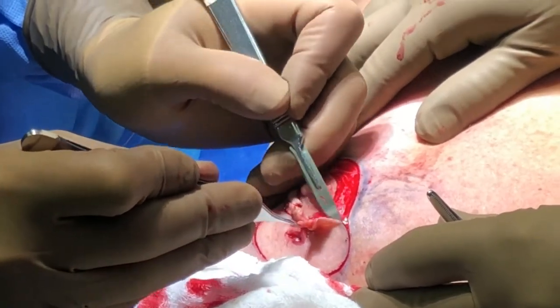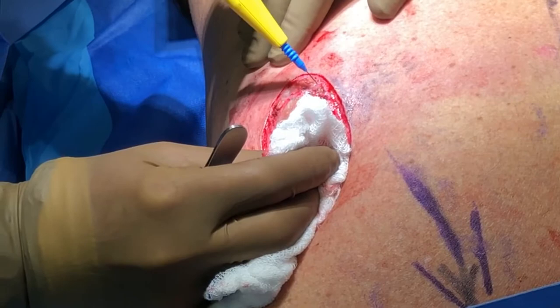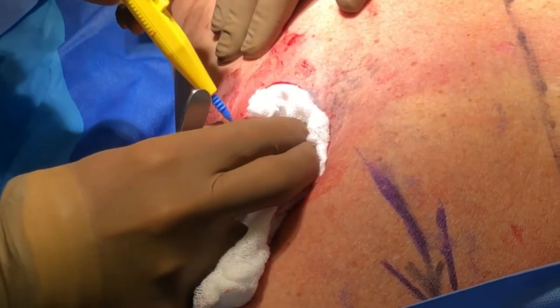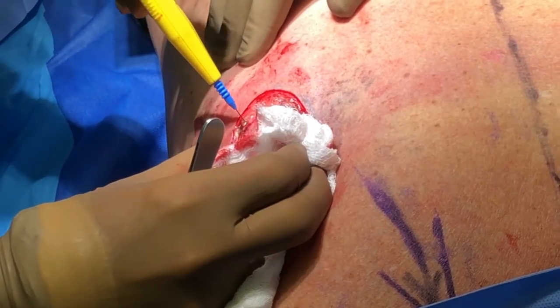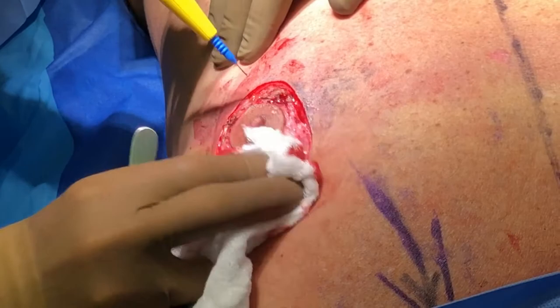We're going to get a fresh blade. And you have to be careful — you don't want to take out too much and leave a dishpan deformity. So we're going to do this nice generous incision. We do our pectopexy, but we normally don't take this large of an incision to perform this.